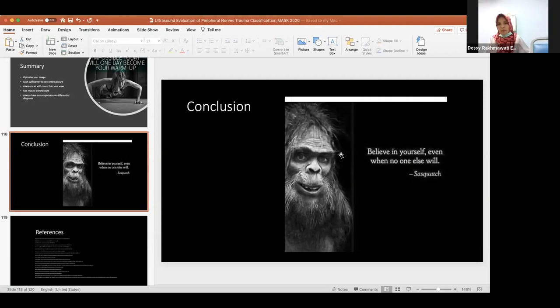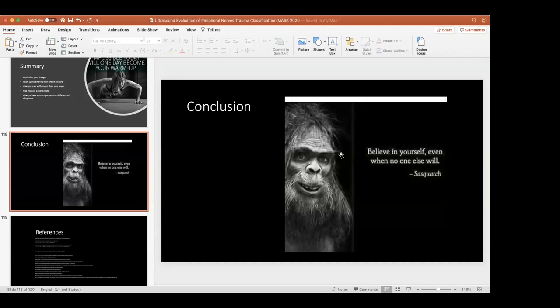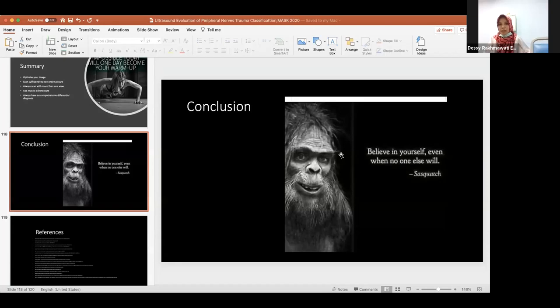It is about the neuropathy after cardiac catheterization procedure. As we know, some of our patients have numbness or just a slight problem that can be normal in two to three months after the procedure. Now the research is ongoing. What I want to ask you is about the ultrasound finding. We have a plan to also do some research for that. For the risk of the neuropathy, our hypothesis is about how close the radial artery is to the radial nerve, and how big the lumen of the radial artery is. Do you think that we can see the abnormal radial nerve by ultrasound for this research? Because maybe the lesion is not so severe, and it can resolve automatically after two to three months. Maybe the problem is just neuropraxia. What do you think?